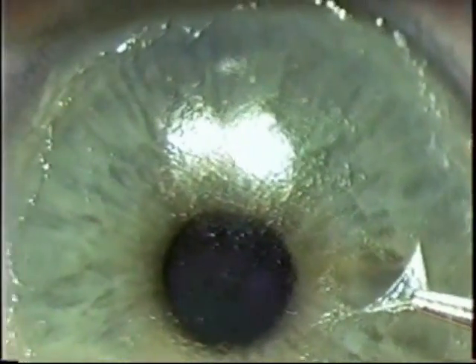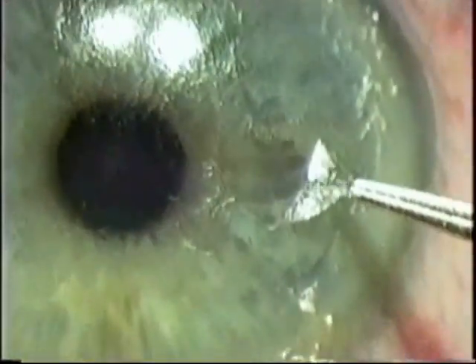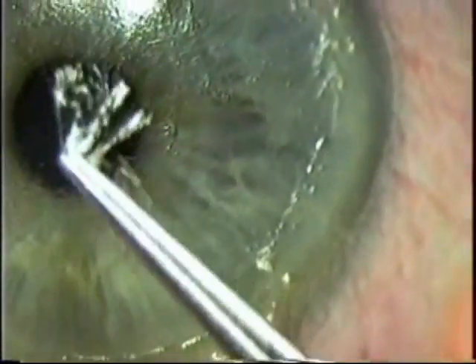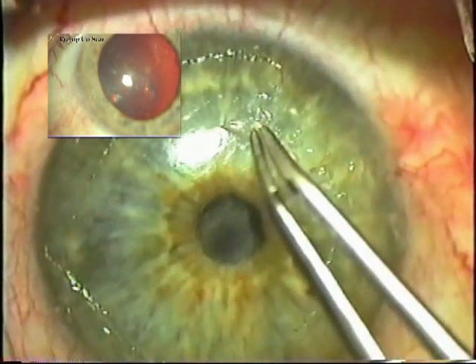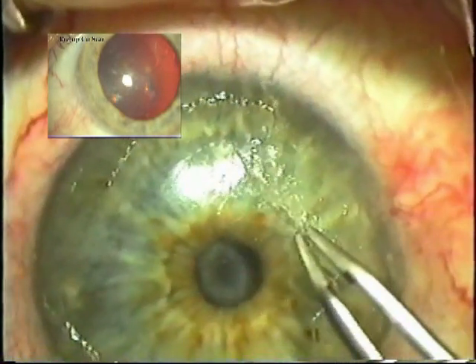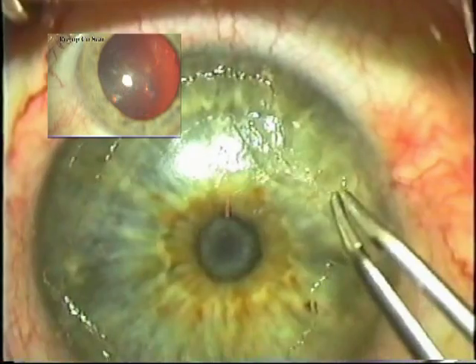For cases of sub-epithelial scarring, these patients can undergo scar peel right under the laser, gently pulling the entire scar so it is removed completely off the normal cornea, followed by refractive photoablation. In cases of more prominent scars, as long as they are superficial to Bowman's membrane, we can still peel them off using the lamellar anatomy to our advantage by creating a resistive guided technique, pulling vertical and away from the central cornea.